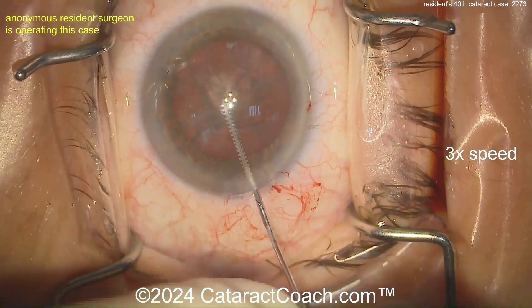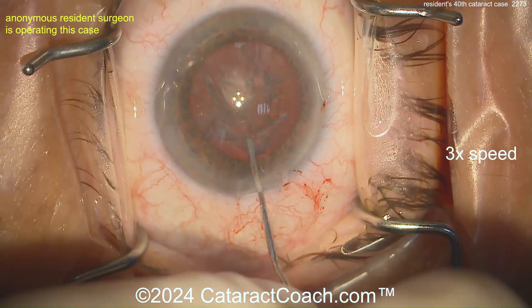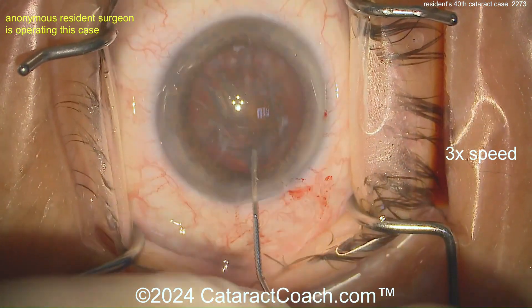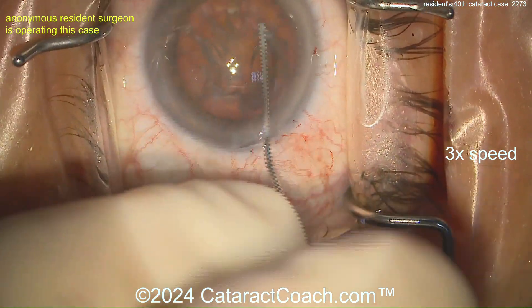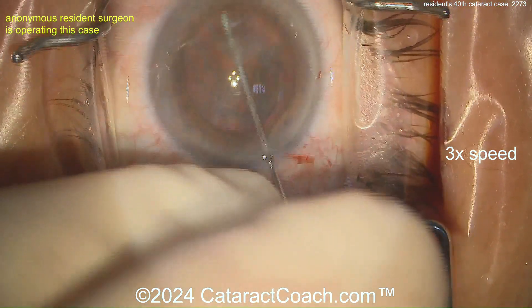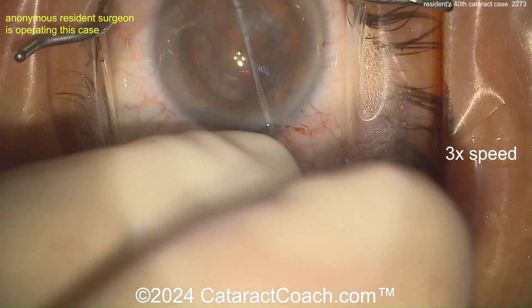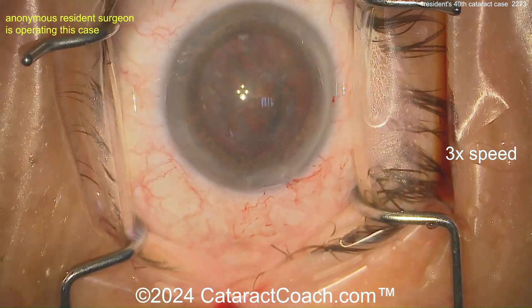Hydrodissection — pretty good for a 40th case. Getting it rotated, again pretty good. A little bit too many fingers in the view here; I'm not sure why we have so many fingers visible. Getting that lens rotated — maybe a little more hydrodissection would help.